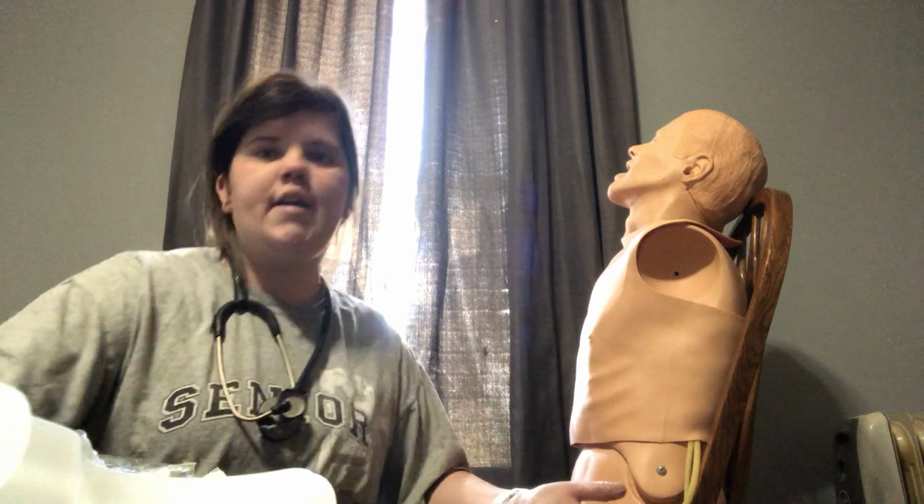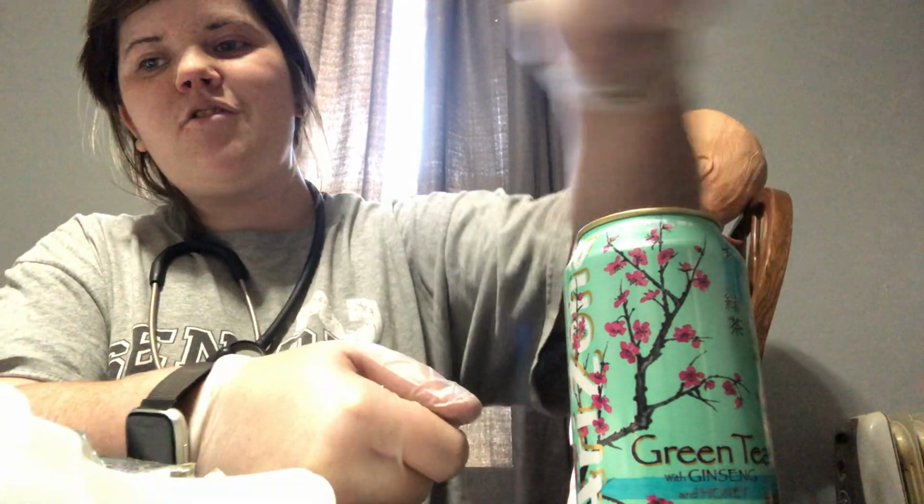So we're gonna set up our tank. I don't have a tank, so this is my tank. We're gonna put our regulator. We're going to align the pins with the holes and ensure that the O-ring is intact and tighten it. And we're going to open the tank by turning the valve 2 full turns. So 1, 2. We're going to note the pressure at PSI of the tank, with 2,000 being a full tank. We're going to listen for leaks.